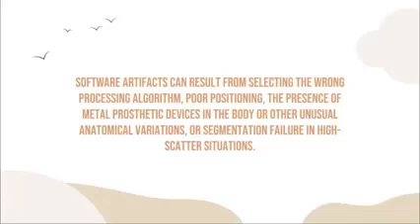So if you are going to imagine this one, medyo kuti siya. Okay? Medyo lisod siya buhaton. So, ang buhaton ninyo ana is, di na lang mo ma'am, two views. Isa-isa na lang gina ninyo per imaging plate. Okay? So, medyo puti man siya. So, ngita mo pumaagi of which you are going to use one image per plate na lang yun.